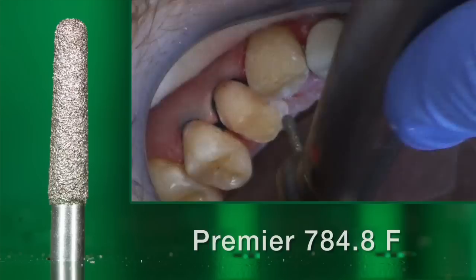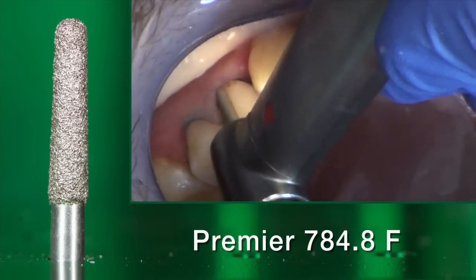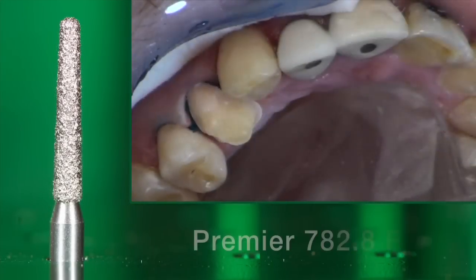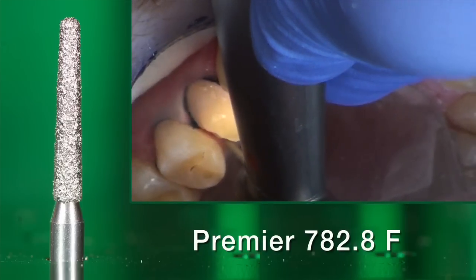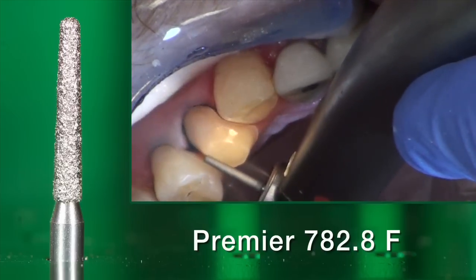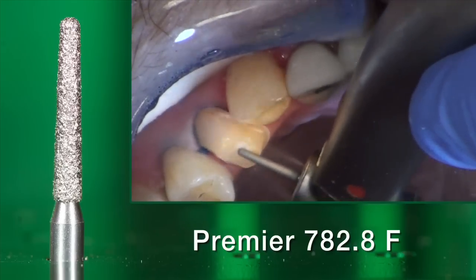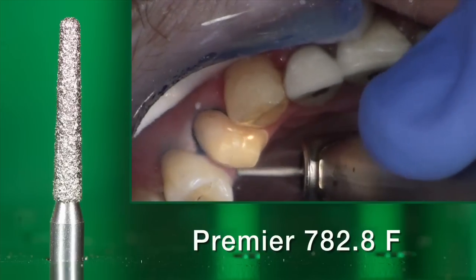For the final refinement of the preparation, I'm going to use a rounded and tapered burr of the same diameter as before, but this one is a fine grit diamond. This gives me more control working around that margin and helps me avoid the J margin we discussed. As my last refinement step, I'll switch to another fine grit round end tapered burr with a smaller diameter at the tip. This allows me to get into the tighter distal interproximal area more effectively and to do careful axial refinement, as well as round the transitions between the occlusal surface and the axial walls. These rounded transitions are very important — we don't want to create any focal points of stress in our final ceramic restoration.